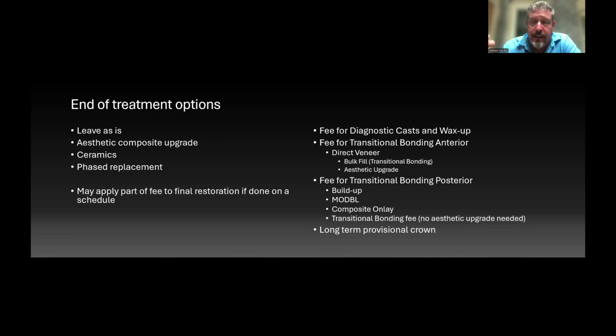I also, if there's a crown, I generally want to replace that crown. At the beginning of treatment, going into ortho, I want to know what's under those old crowns. So if it's an old PFM, I'm cutting it off, I'm cleaning it up, and I'm placing a long-term provisional crown, and there's a fee for that.